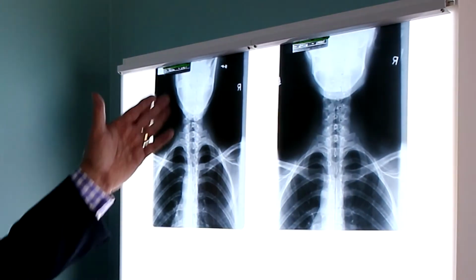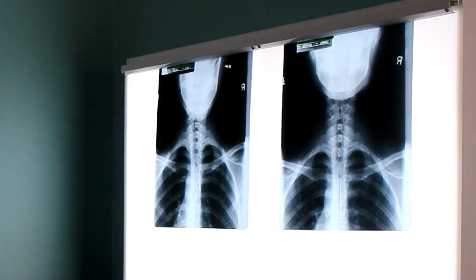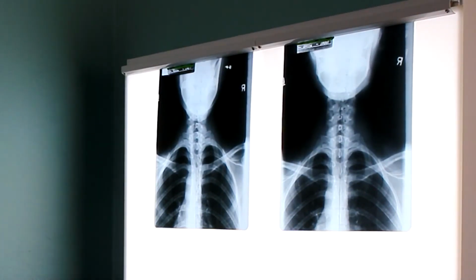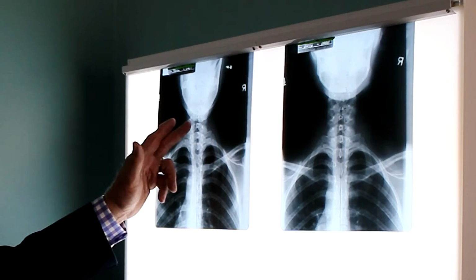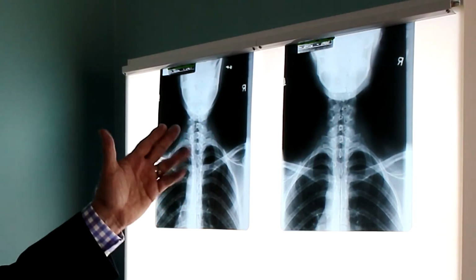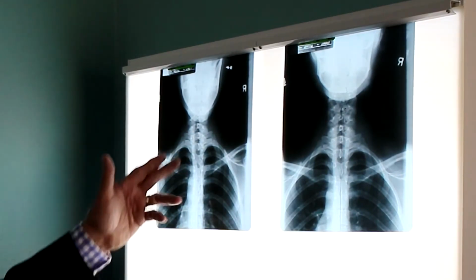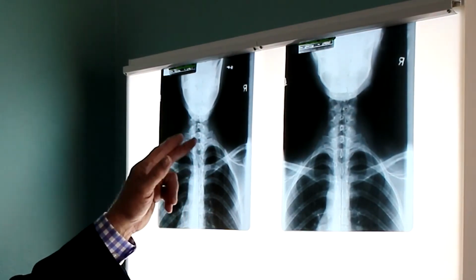This x-ray, dated 4/11/2016, is of a patient who was involved in a serious motor vehicle accident complaining of neck and back pain. You can see where the spinous processes of C6 and C7 are rotated to the right. The entire thoracic spine from T1 through T8 laterally deviates to the right, and the spinous processes are rotated to the right from T1 through 8.